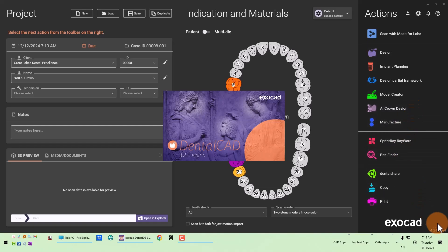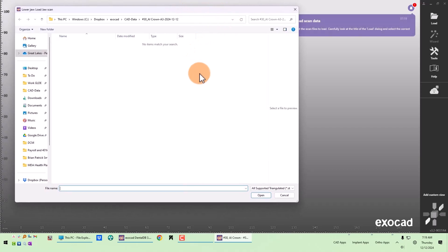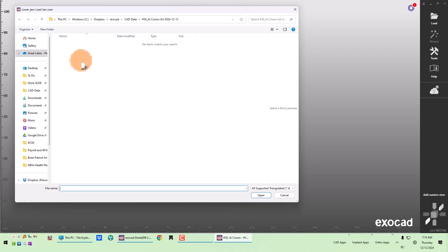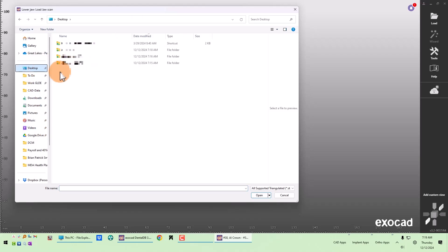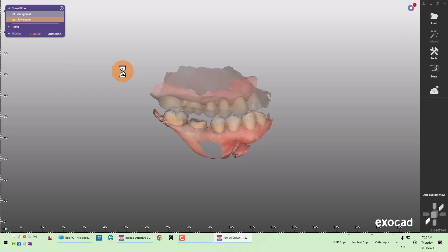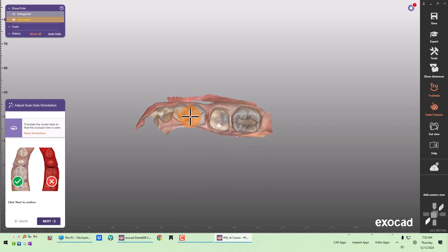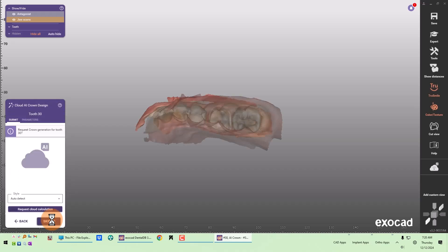For your information, I'm using build number 9037 — this is the latest build as of today's date. Just like in the regular crown workflow, it asks you to load the jaw scan, so we're going to load the scan files, orient our scan, and after orientation the next step is cloud AI crown design. ExoCAD is asking to request crown generation for tooth number 30.